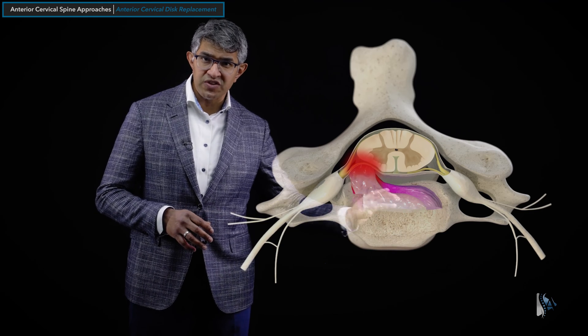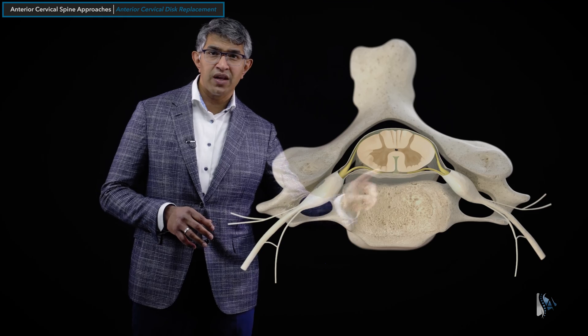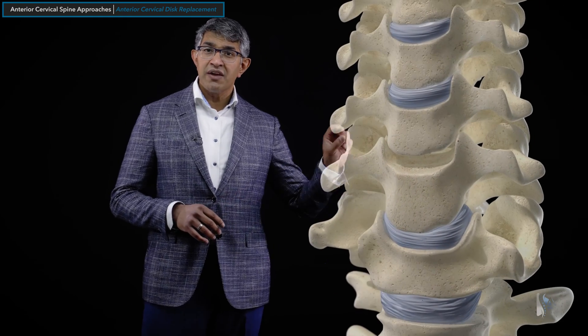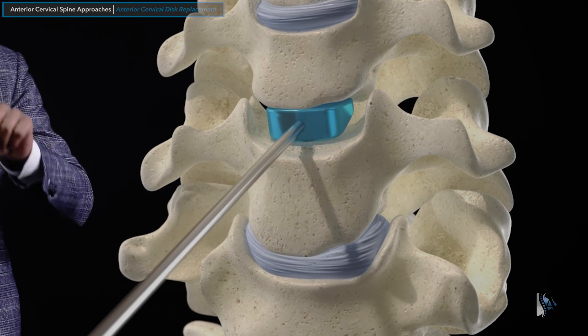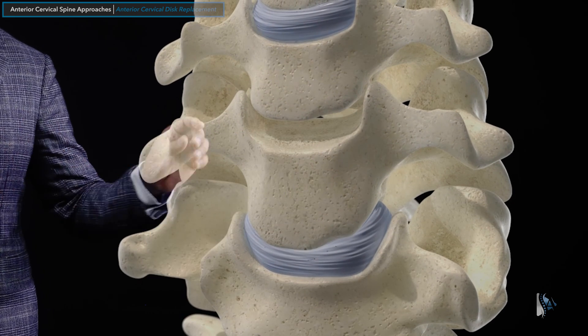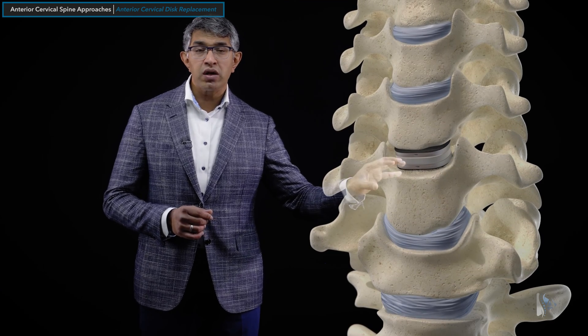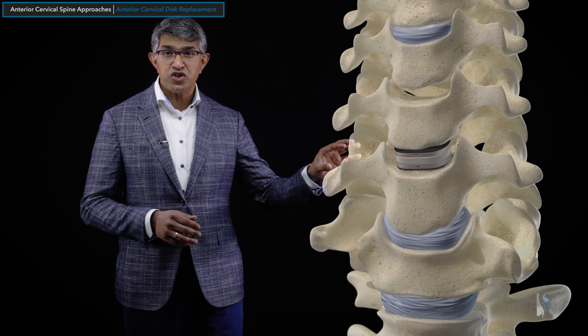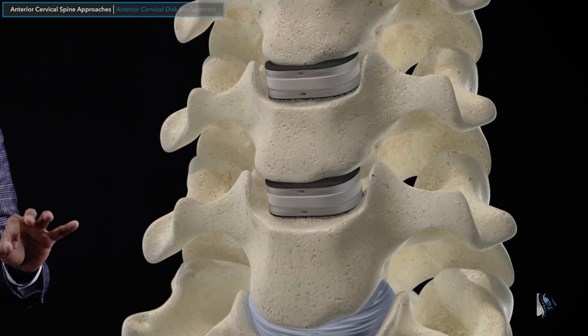We remove the disc in this procedure and remove any herniations pressing on the nerves on one or both sides. This creates a gap, and that gap is filled by a device — but this time a device that allows for preservation of motion. We use a trial to select the right size implant, and this generic disc replacement device shows how it fills the gap. It can be done at one or two levels generally.